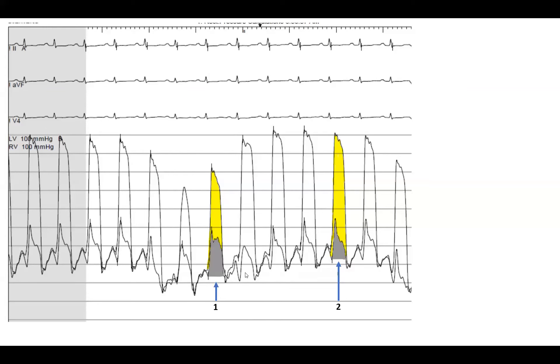This is what you should look for: the systolic discordance. Some at Mayo call it the systolic area index — that's what it is, it's that pulse volume comparison.